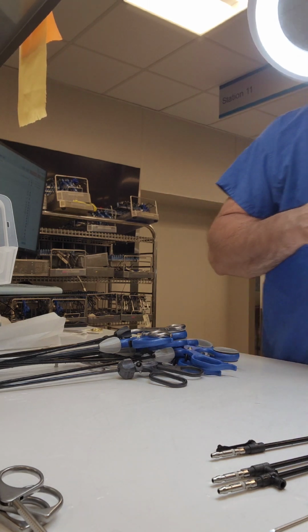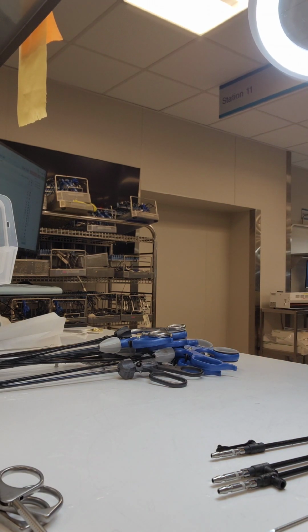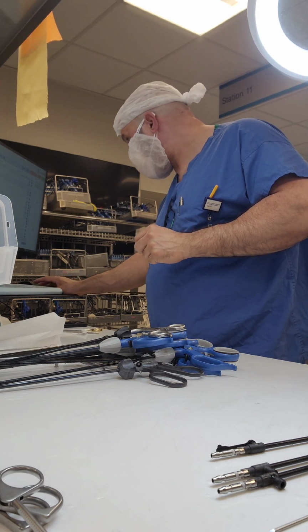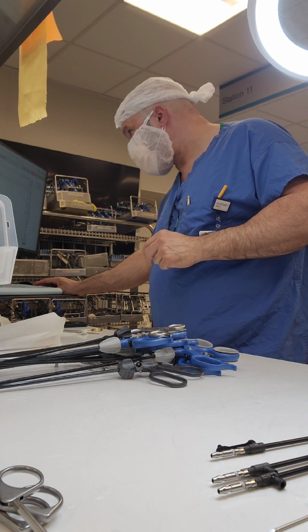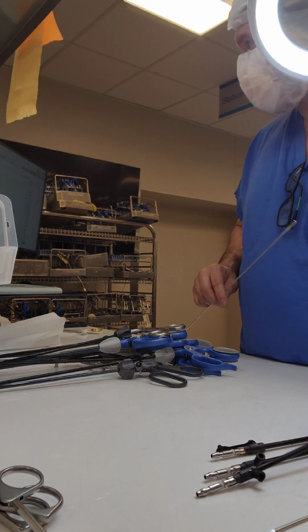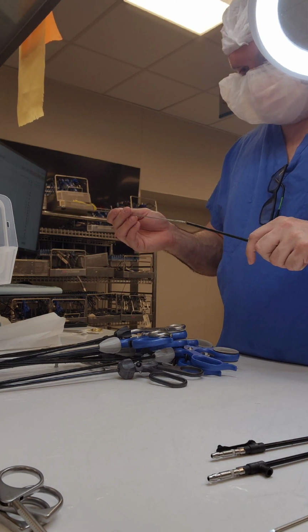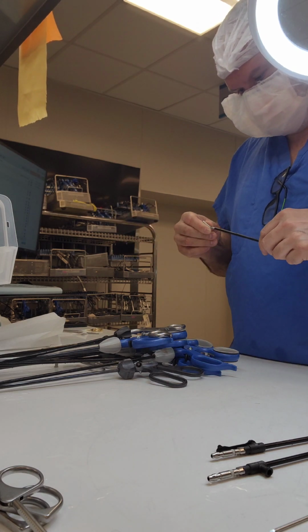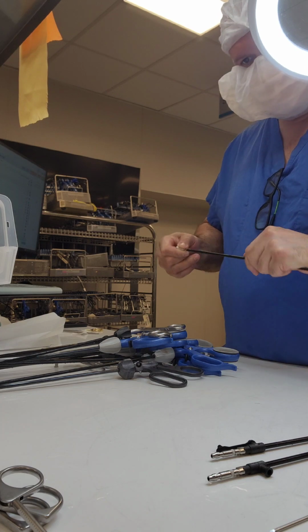Checking that jaw, making sure that it opens and closes fluidly. Here's where you have to look at your part numbers if you're not familiar with your laparoscopic instruments. I continue this process for instruments that come apart. I've tested it, I checked for cleanliness, now I have to function test it.